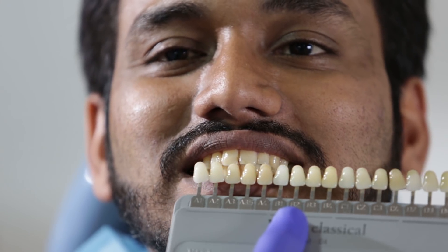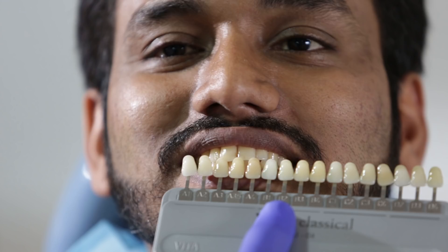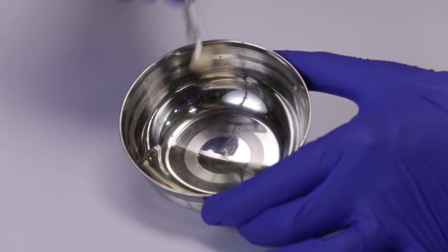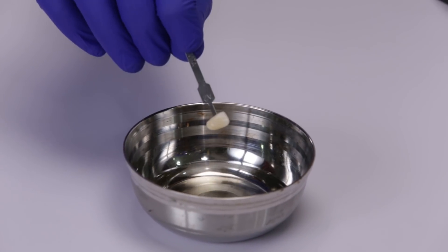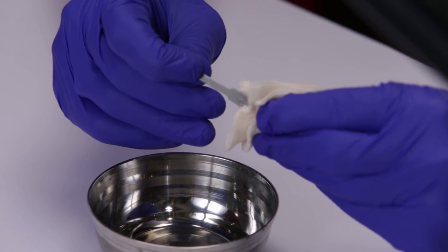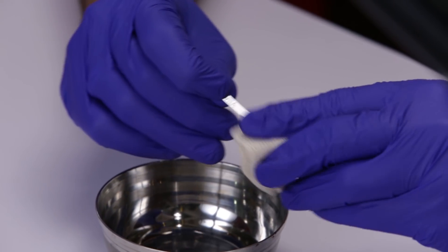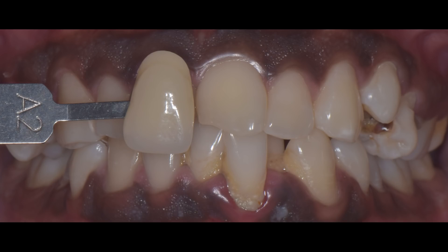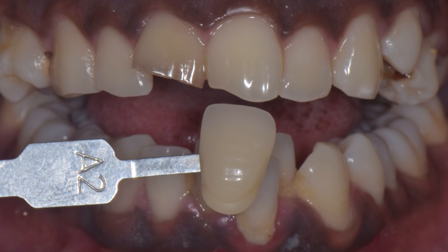Always try to rest your eyes when multiple shades are involved. Look at a neutral gray colored object to rest your eyes — that is exactly the reason why shade guide holders are always gray in color. Another factor is that we always cold sterilize our shade tabs in a liquid medium like glutaraldehyde, which causes them to get faded or worn out. So it's a very good habit to replace your shade tabs with new ones every 2–3 years. It's also important to determine the shade of the tooth before starting the procedure, as the teeth tend to get desiccated during treatment, and even the chair light constantly on could contribute towards desiccation.